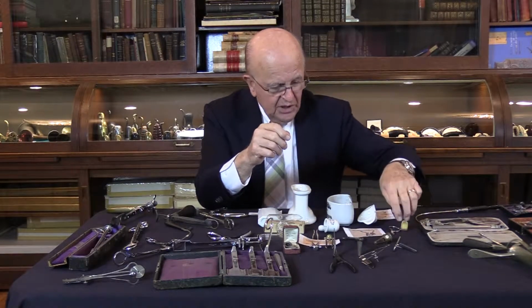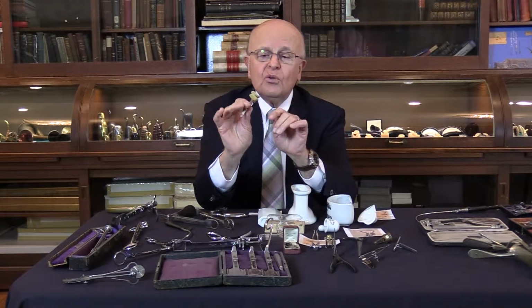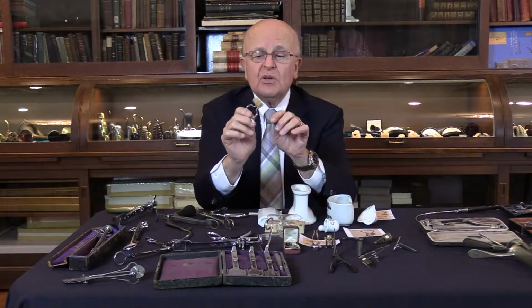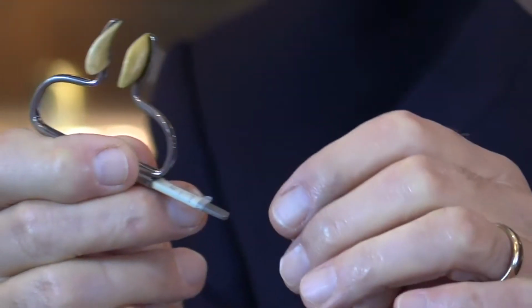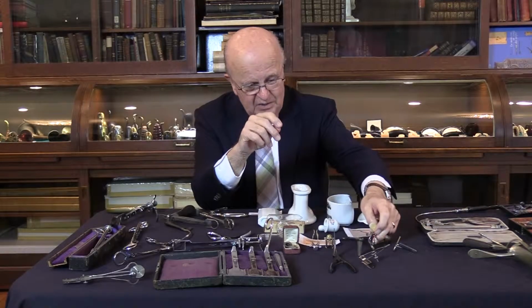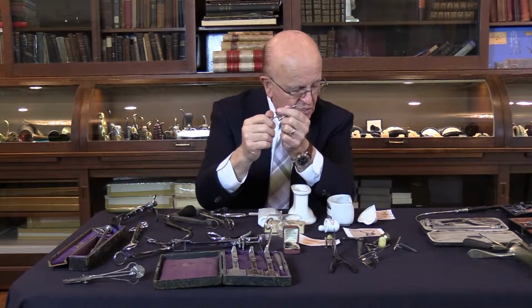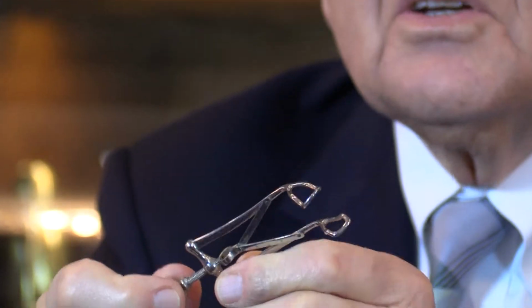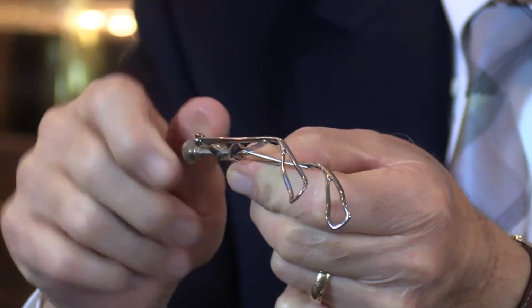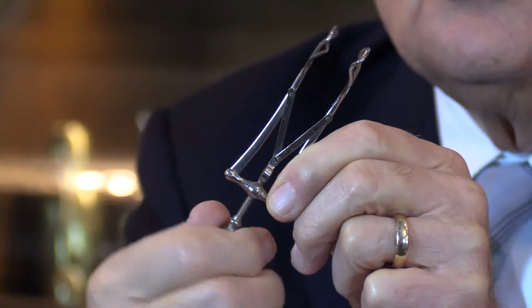I have one more example of the Myle's. I should have mentioned it before. This is a very, very old example of a Myle's nasal speculum, and as you can see, this is made of ivory. So this is an early version of that. Another way of examining the nose is the use of the Frankel nasal speculum. As you can see the mechanism here, this screw will push this and open it, or pull it and close it.